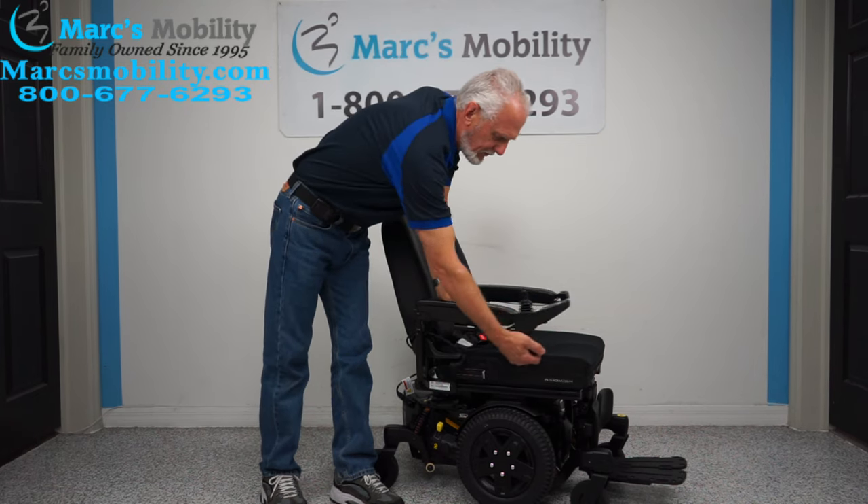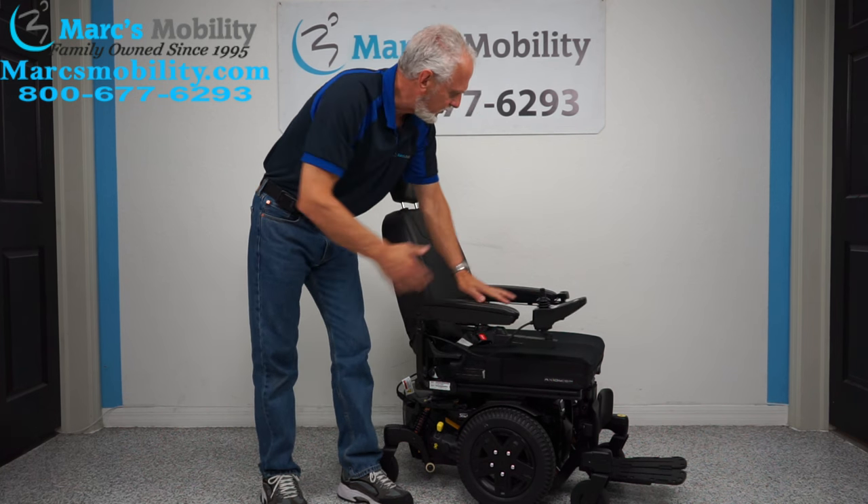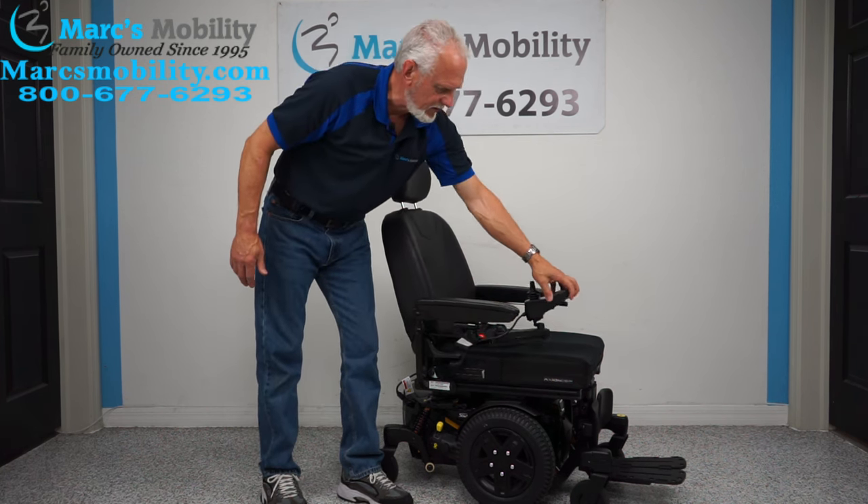You do have a swing-away on this one also. You can swing the joystick away from the front. If you're left-handed, we'll put the joystick on that side and it'll swing to the left side.